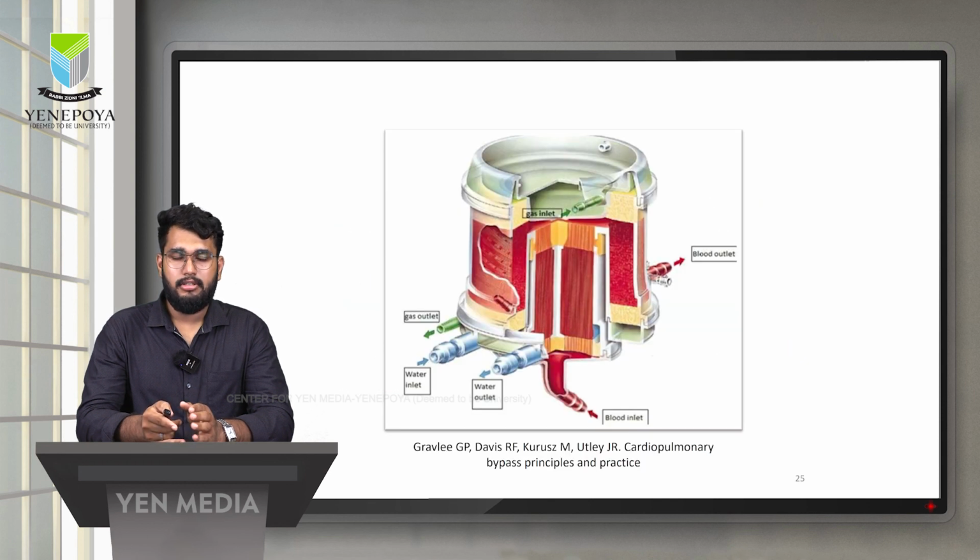So this shows the modern blood flow in a membrane oxygenator. As you can see, we can see the blood inlet, blood outlet, hollow fibers, gas inlet and gas outlet, and water inlet and water outlet.